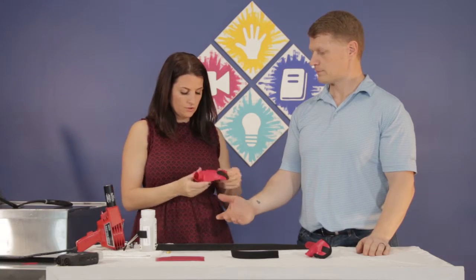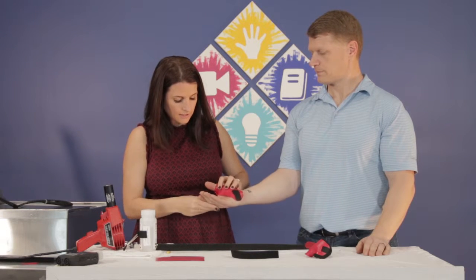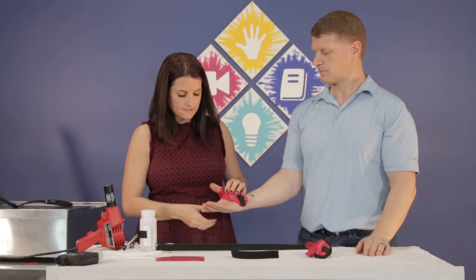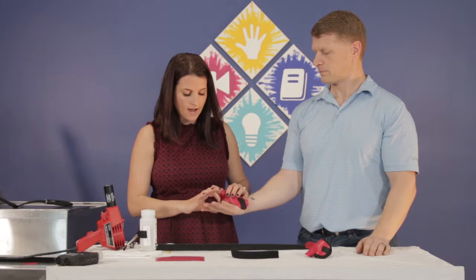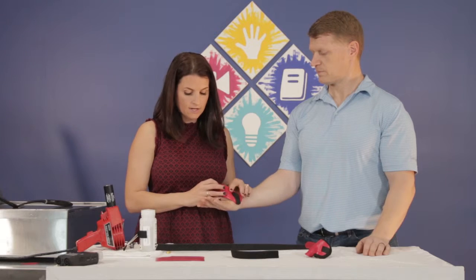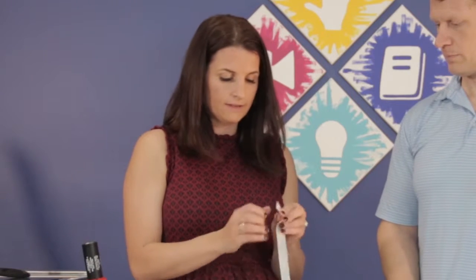I'm going to do a quick test fitting. One thing to make sure is that this is really far below the A1 pulley — this is a common issue when people are using it and really flexing into it. If it's too high, it irritates it and they end up with a little flexor tenosynovitis. So that's something I always watch for when making the splint.